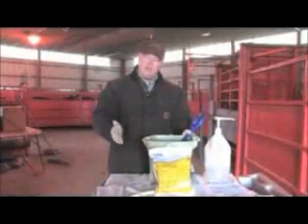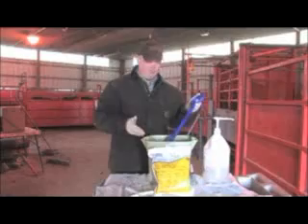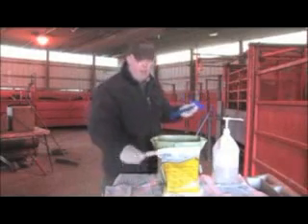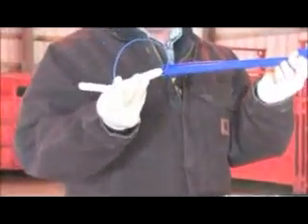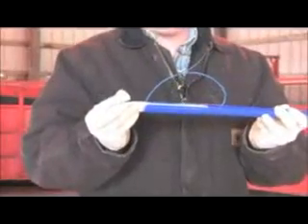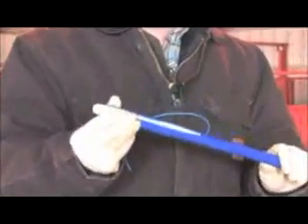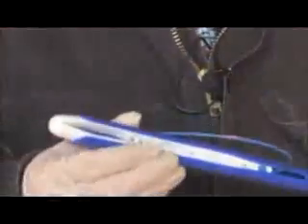Now I'm going to demonstrate how to load the CIDR applicator. The CIDR applicator is in the water that contains the mild disinfectant. Remove the CIDR applicator from the water, shaking to remove excess water. The CIDR has a tail, the body, and two flaps. Insert the tail of the CIDR into the applicator, trying to ensure that the tail is pointed down out of the groove. Next, fold the wings of the CIDR in, collapsing them together.